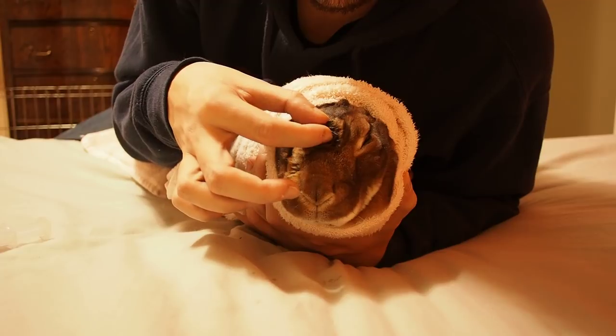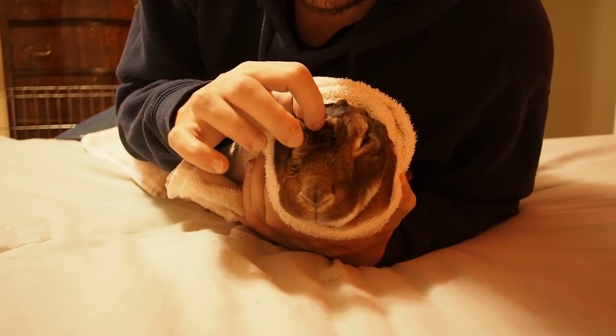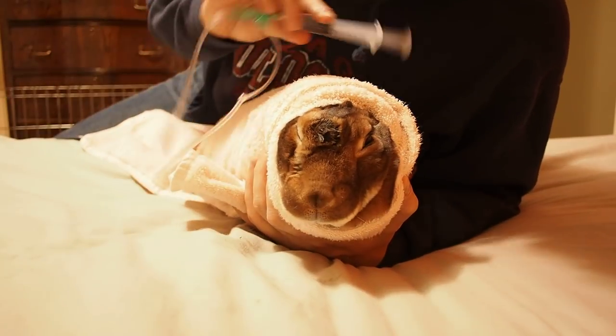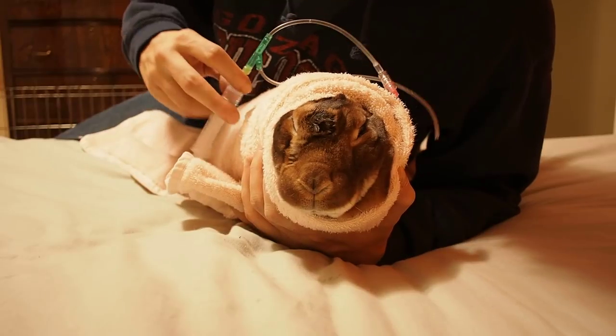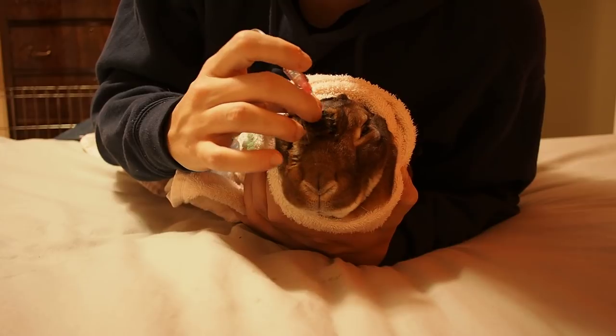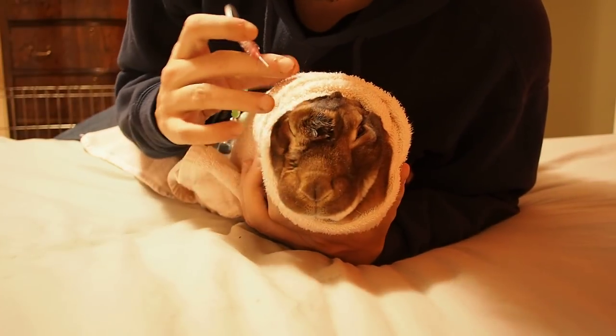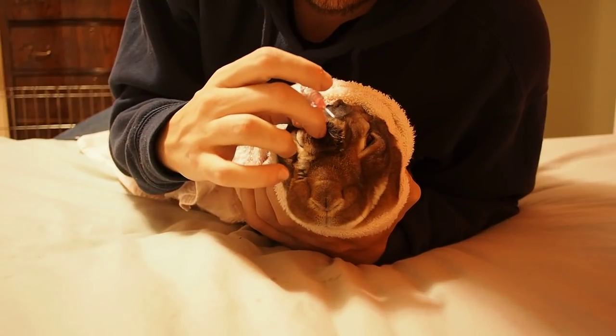You search for the port, which is right here. The port — the center of the port is a little gooey. Now my technique is to put this off to the side, search for the port. This is going to hurt for both of us — she's going to hate this, and I'm going to hate doing it to her, but it's going to have to get done.